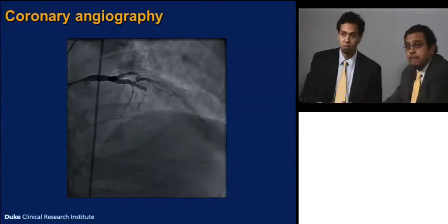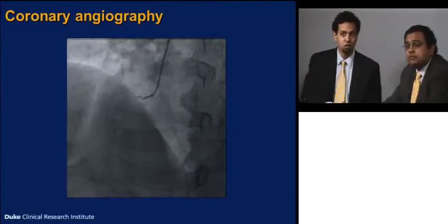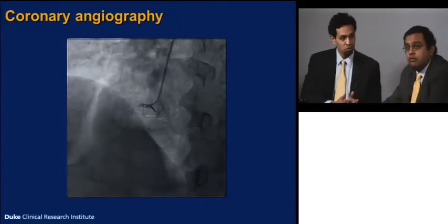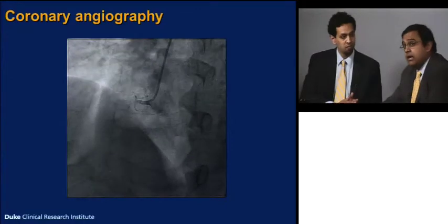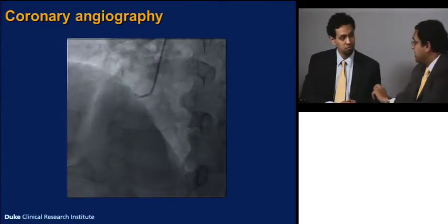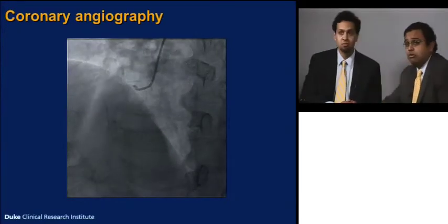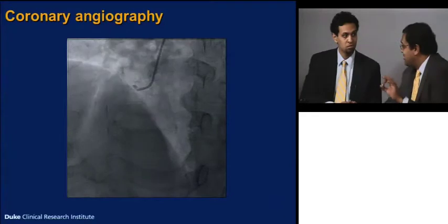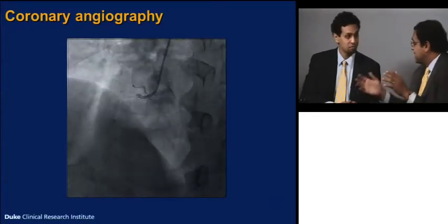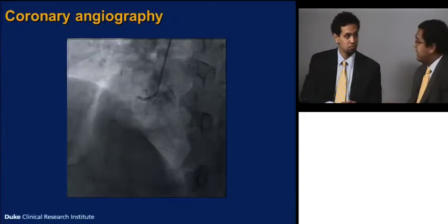Well, it's a good anticipation on your part. The right looked like it was chronically occluded, and so they were concerned about maybe an acute occlusion in the left anterior descending artery and then this chronic right. That's a great point, and now I'm going to give you the imaging interpretation from the guy in the cath lab. I agree. I think this one's maybe more chronically occluded. I can tell you it's less favorable than the LAD because the LAD is a large territory and the occlusion seems short. So, at this point, Adrian, what would you say?